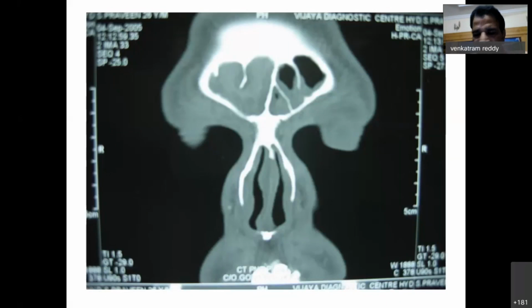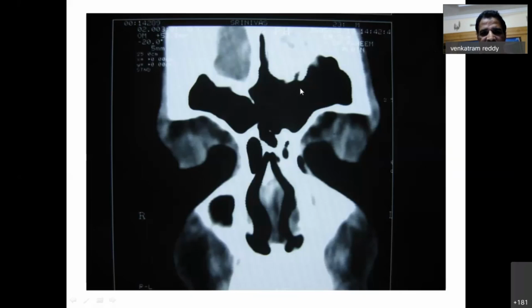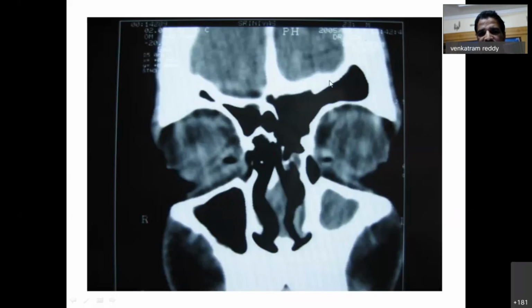And coming to frontal sinus pathology, frontal sinus is one of the most variable sinuses next to sphenoid sinus in occurrence of paranasal sinus pathology. You can see the frontal sinus is unequal. There is complete opacification in this, and there is an incomplete septation with a partial pathology on the other side. Now you can see this frontal sinus with a gutter-like pneumatization going into the frontal lobe here. And herein you can see the far lateral pneumatization going up to the lateral wall of the orbit. The pathology here is very difficult to access endoscopically.